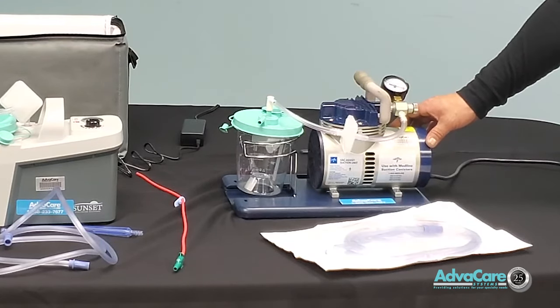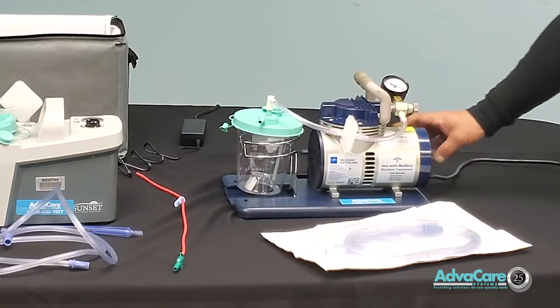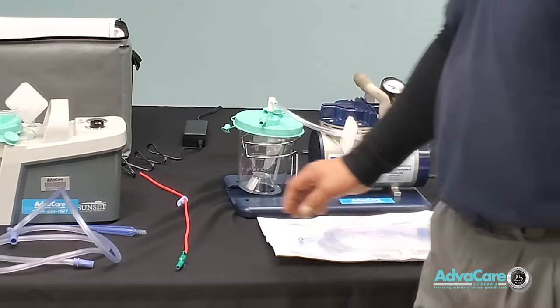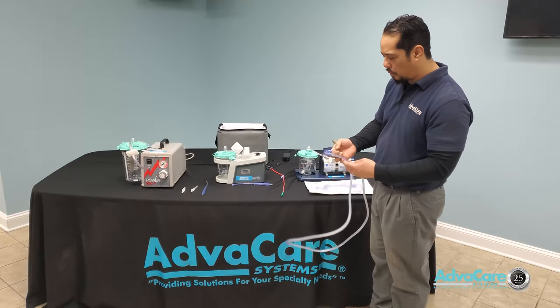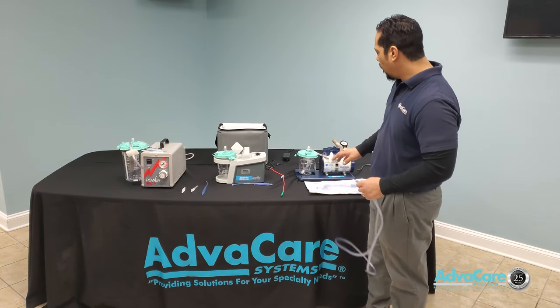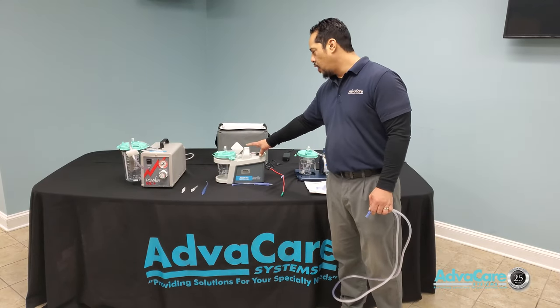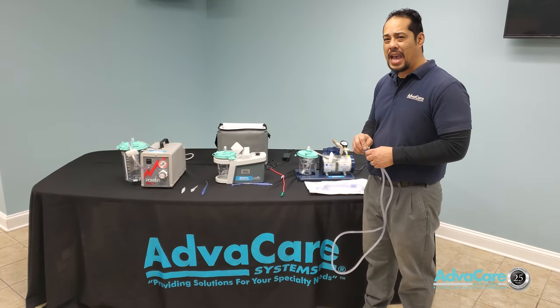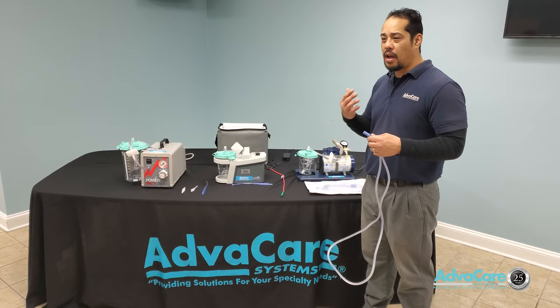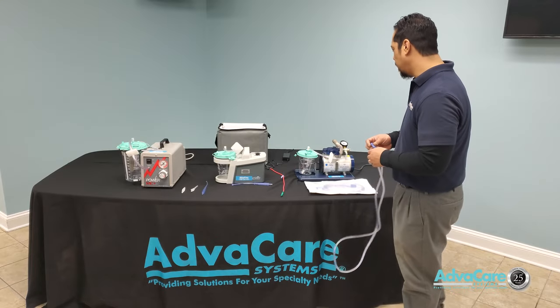When you initiate power, you should hear the air compressor turn on — that lets you know the machine is functioning and operable, and you are ready to connect the rest of the tubing to the patient. Most continuous suction therapy from a stationary or portable machine will usually last about five seconds, just long enough to clear any fluid blockage or mucus buildup the patient is experiencing.